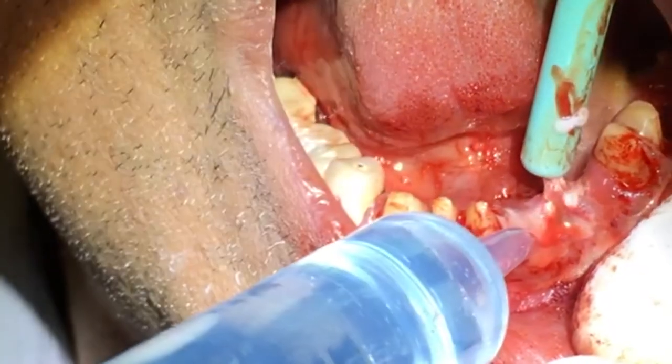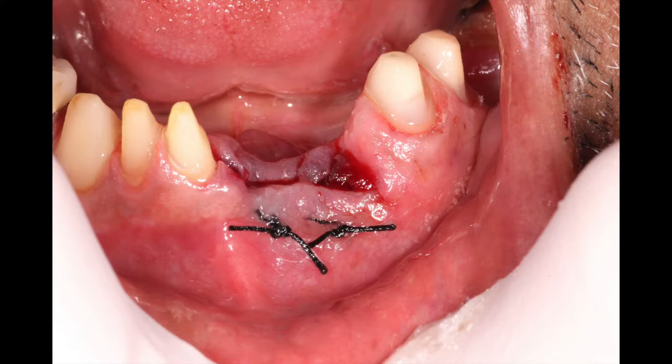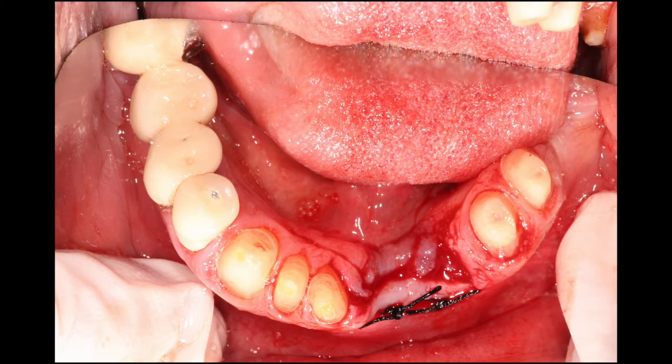Lastly, we're going to close up the site by placing stitches. In this case I use what I call box stitches — I've got two of them placed. It's where I start from the buccal, go underneath the flap to the lingual, come around laterally, come back through the lingual, and come back out through the buccal, and tie it off on the buccal.